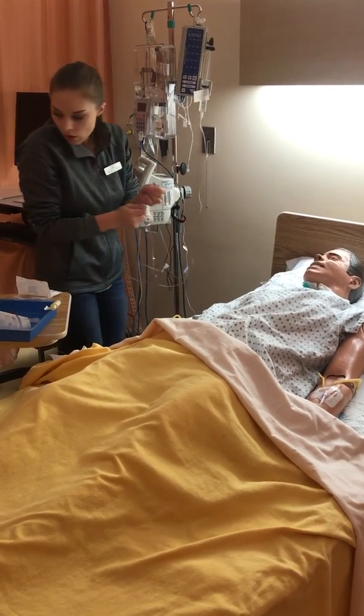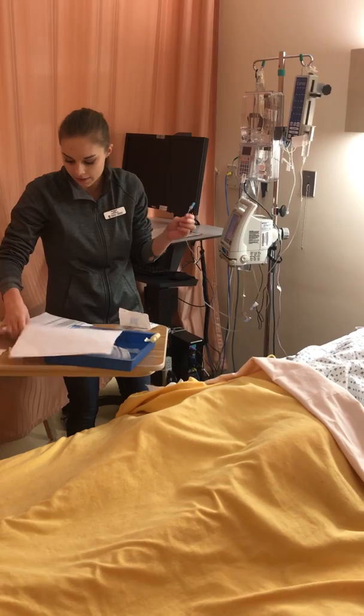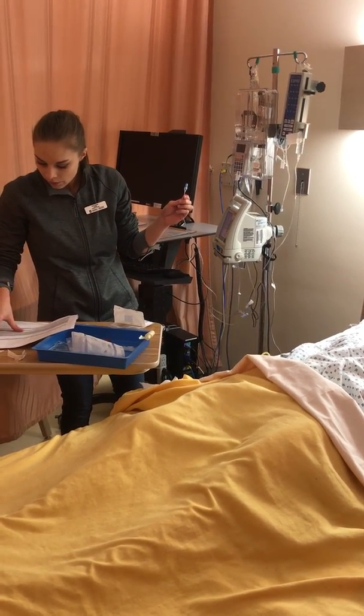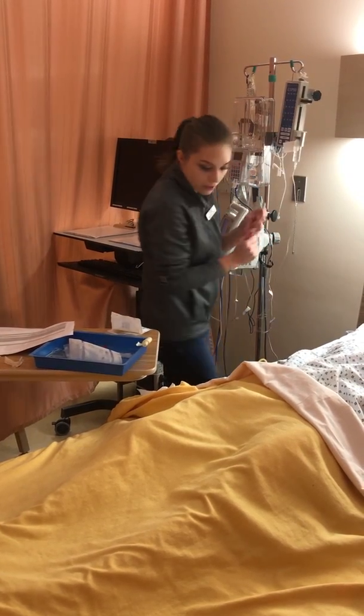Okay, so according to my CIVA instructions, it's at normal for 35 minutes, so I'm just making sure that that's where my plunger is, and it is.